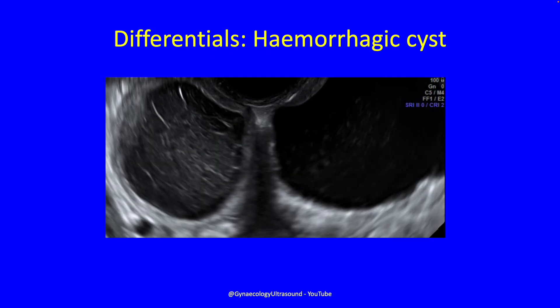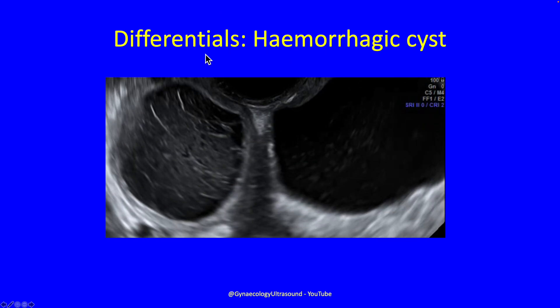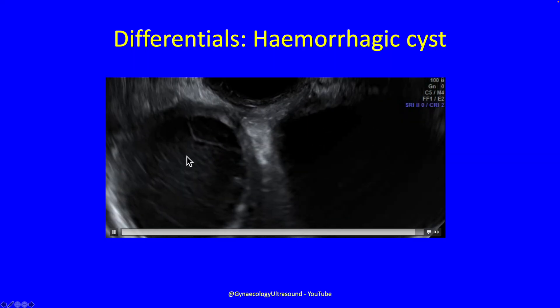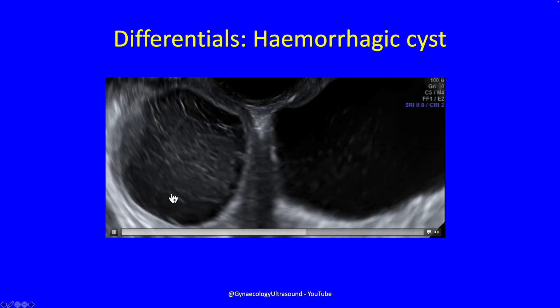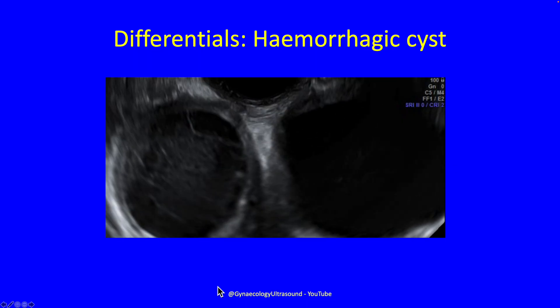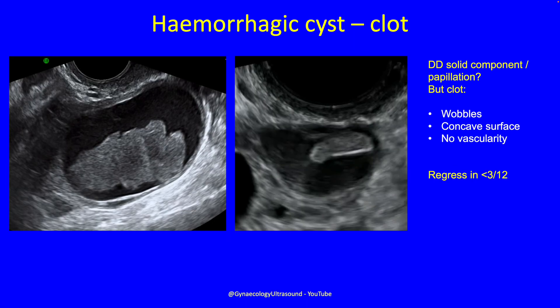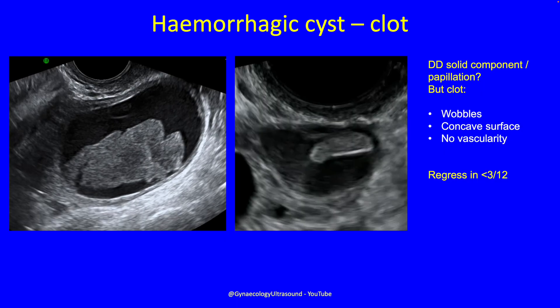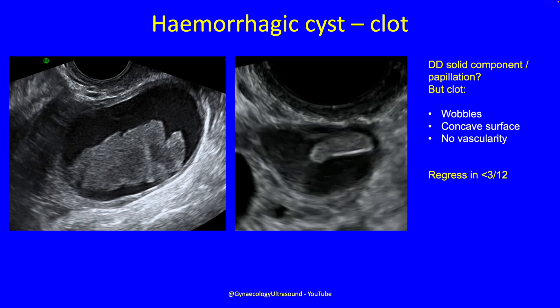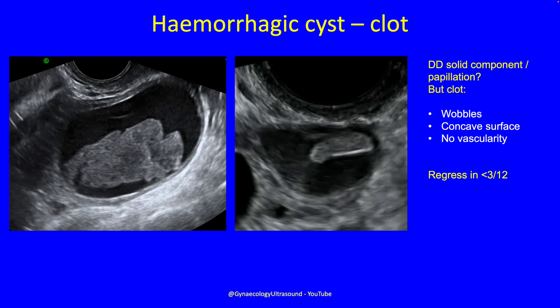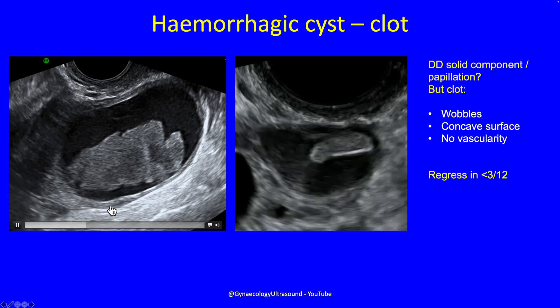One of the differentials is a haemorrhagic cyst. Here on the left of the screen, this is a unilocular cyst with mixed echogenicity contents. There are some fibrin strands running across the cyst, indicative of fresh haemorrhage. A haemorrhagic cyst can contain clot, which you might think initially is a papillation or solid tissue, but clot wobbles — and solid material never wobbles.